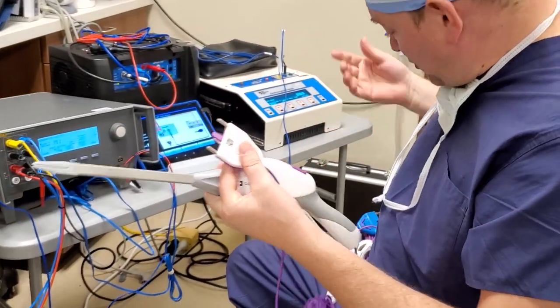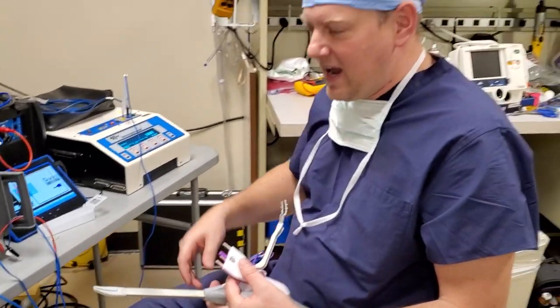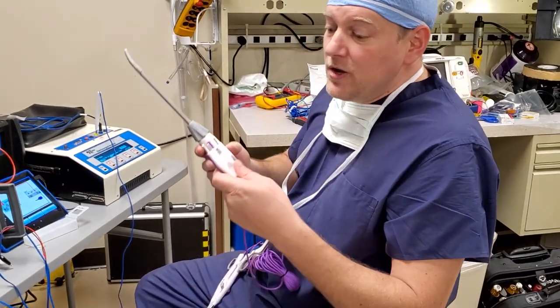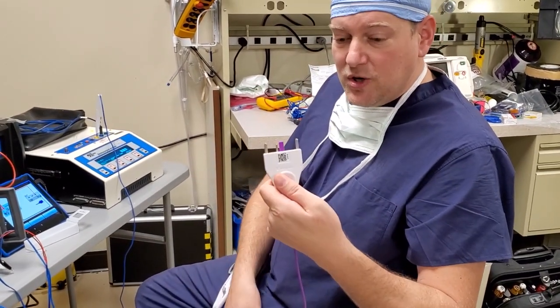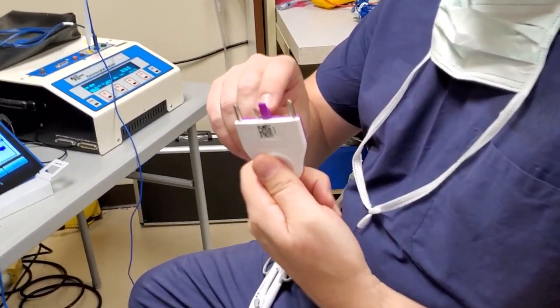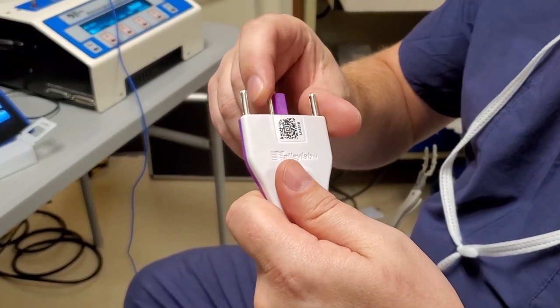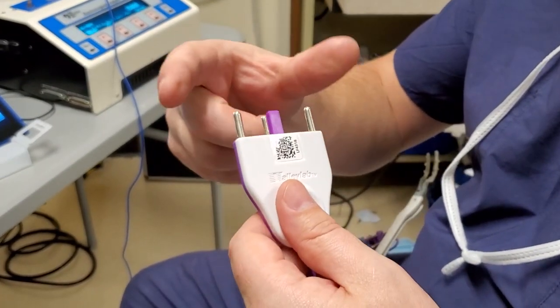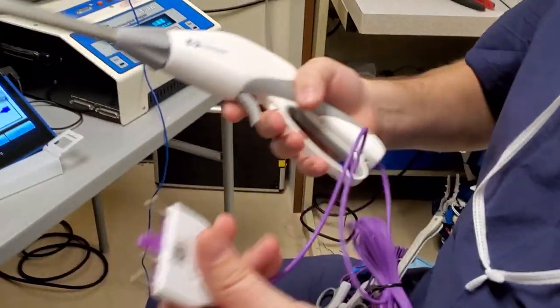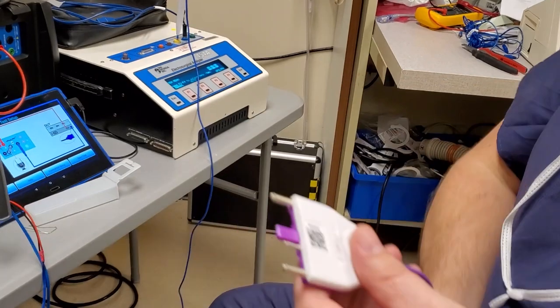One thing you should know about every one of these devices is there's a different method for activating the handpiece. Here it would register with a QR code. Notice there's also a dongle in the middle which activates some tiny micro switches, and there's also a little shorting pin to activate the bipolar energy. Because this is basically bipolar — bipolar that monitors resistance, but it's still technically bipolar.